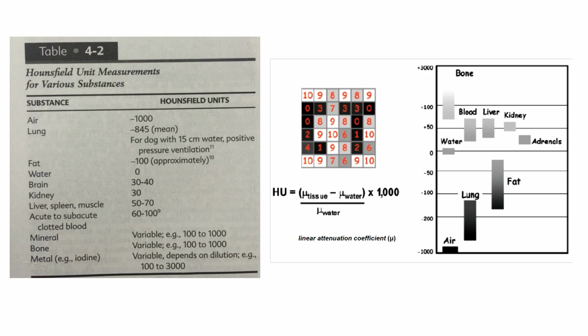This chart is showing various measurements of CT units, or Hounsfield units, for various substances. Zero is represented by water, while minus 1000 is represented by air. As we go toward the metal side, it increases up to about 3000 CT units, or Hounsfield units, while bone is approximately 100 to 1000 units.